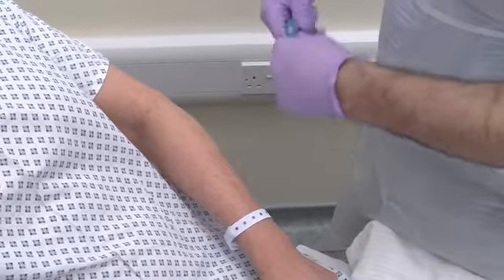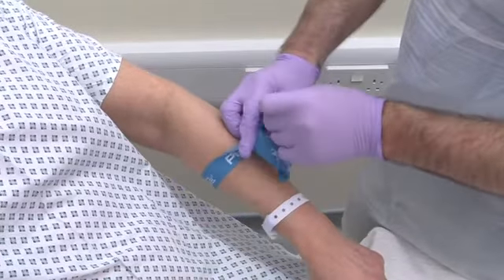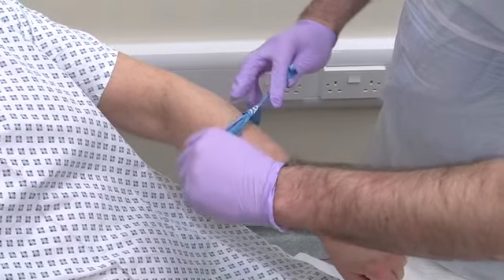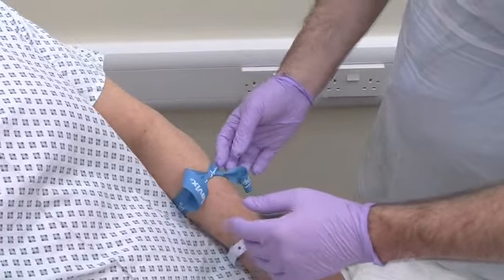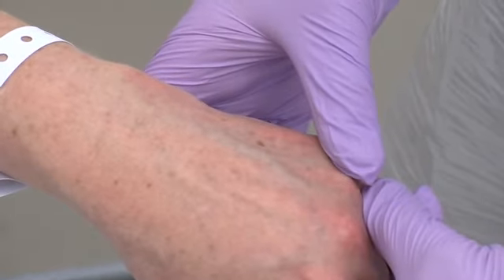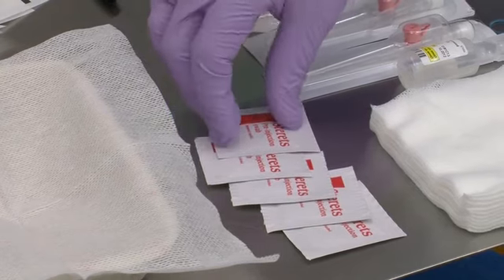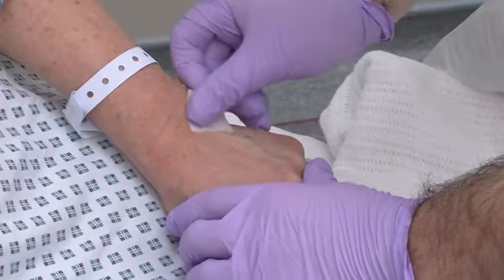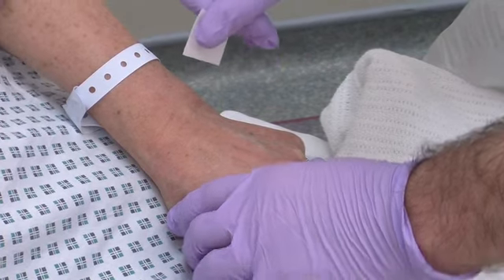Begin by applying a tourniquet to the patient's arm. Inspect and feel for veins at an appropriate site. The basilic vein is used here. Cleanse the area around the vein thoroughly using an antiseptic wipe. Allow 30 seconds for the area to dry.